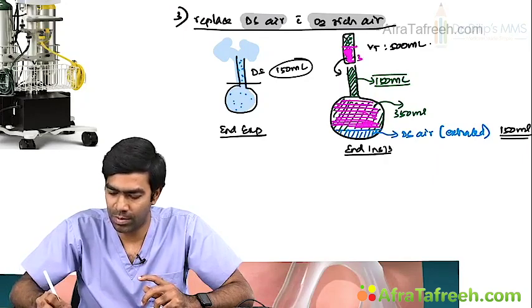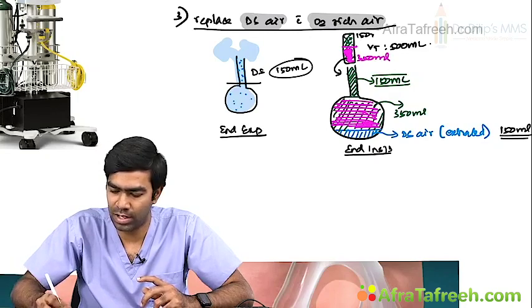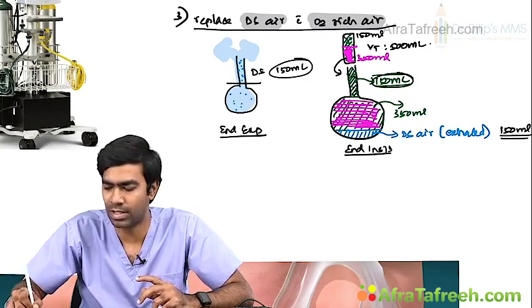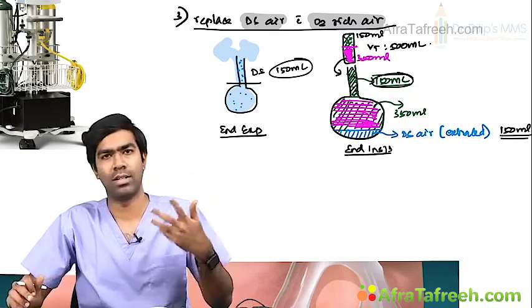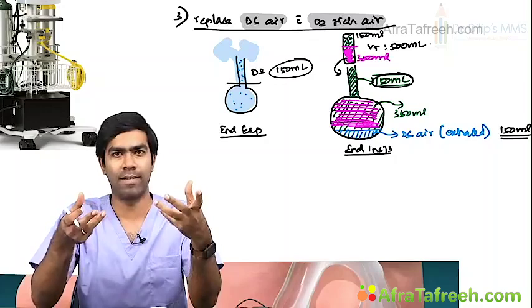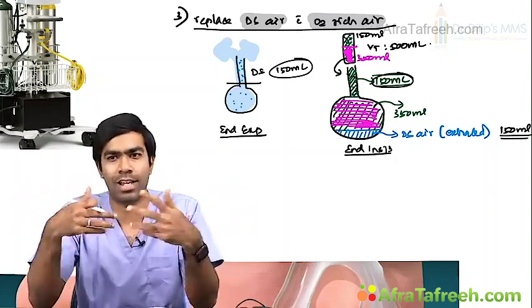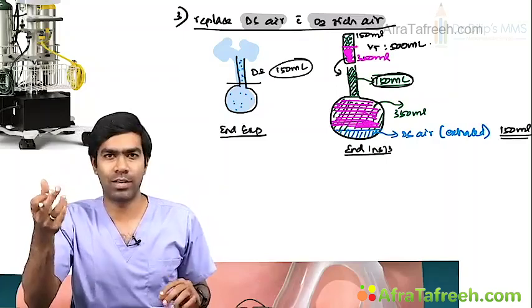This initial 350 ml. The final 150 ml that you are taking is absolutely no use, because it's going to be present in the dead space, which means they are just going to be exhaled in the next exhalation cycle. That is also one reason why during the earliest part of exhalation, you will not have any carbon dioxide at all. It's just the oxygen rich gas that you are exhaling. So this is the basic idea of this pulse dose oxygen delivery also in LTOT.